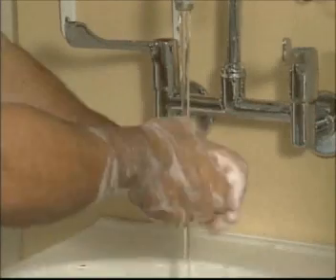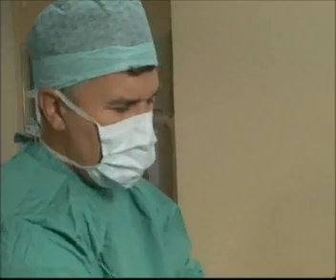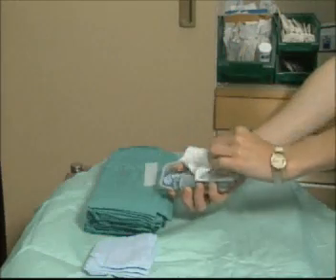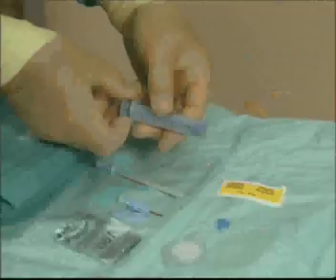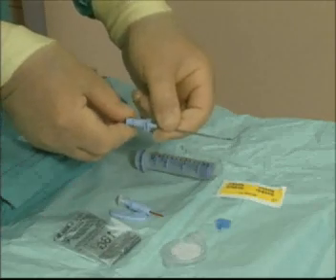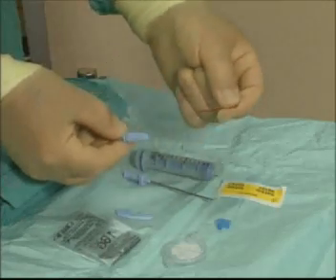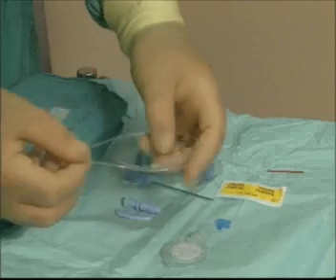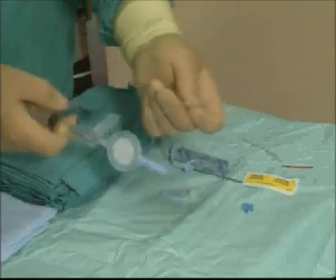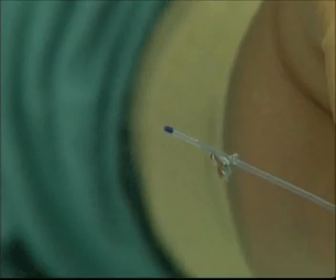This is a sterile procedure. Hands must be washed and gloves put on. Towels are prepared and the epidural pack is opened. The syringe plunger and needle stylet are checked for free movement, the insert is removed from the lure connector, and the catheter is unpacked and uncoiled. Patency of the filter, lure connector, and catheter are checked by flushing with sterile saline.